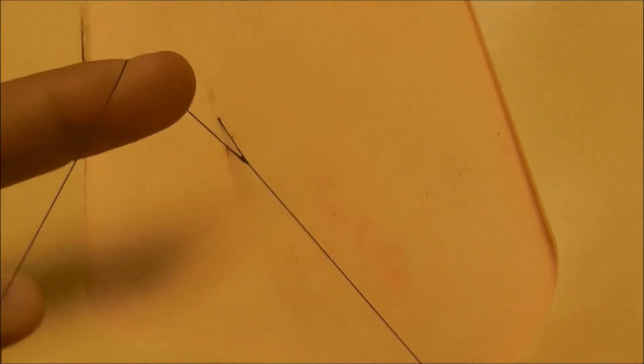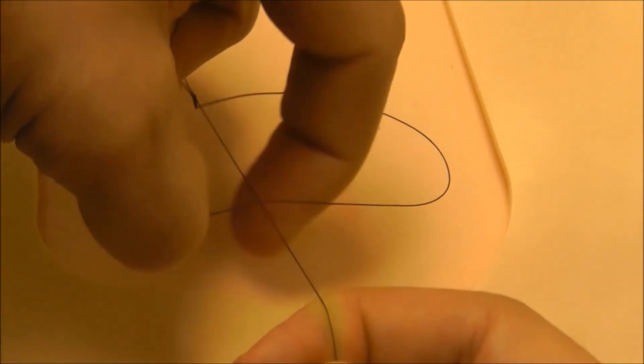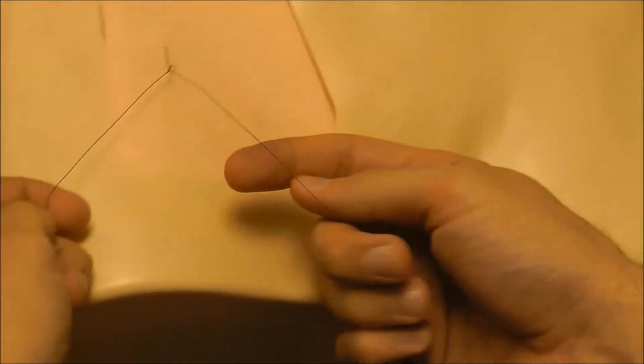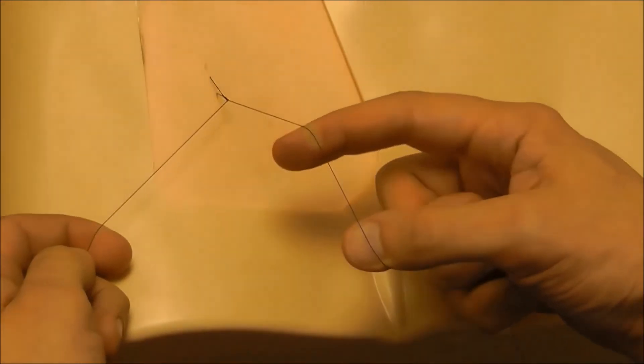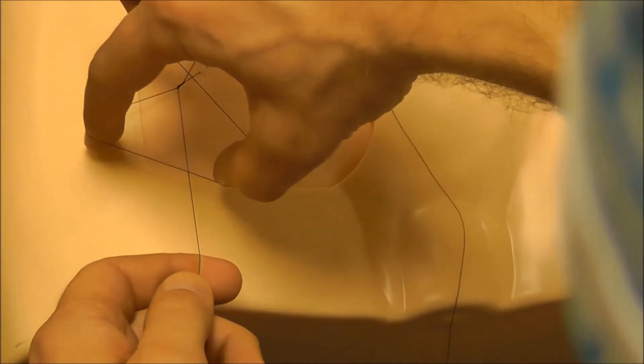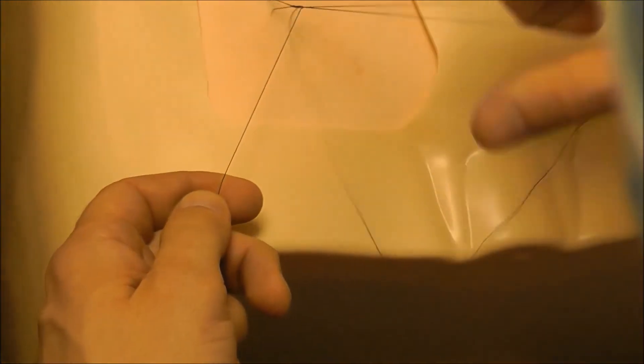Spread this between your index finger and your thumb, put it over on top, then come over here, grab that line, and pull it up through the loop. So I have my line here, put it on top, and pull it up under through the loop. If I switch hands, I spread the line between my index finger and my thumb, put it on top there, and then just pull it up and underneath.